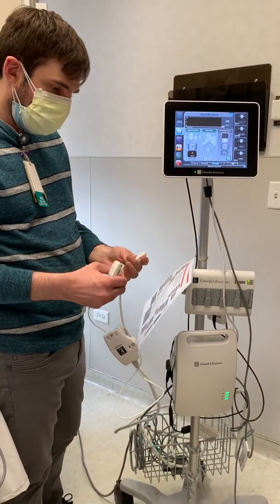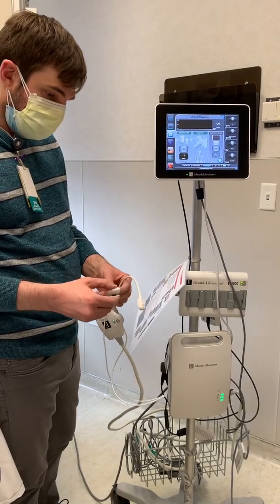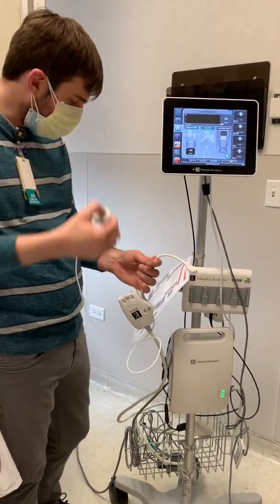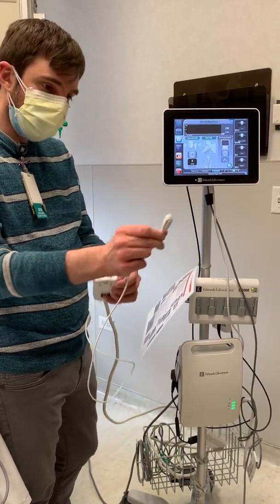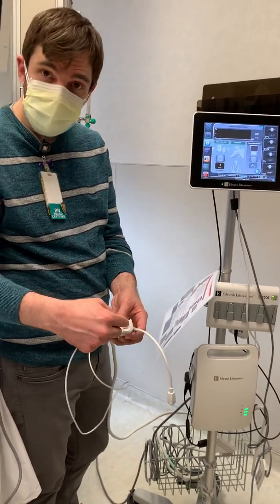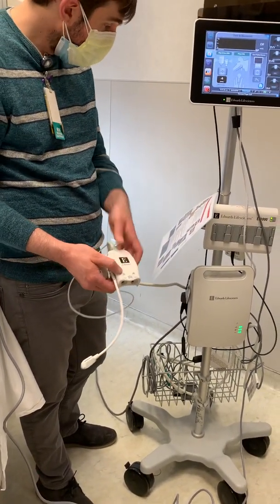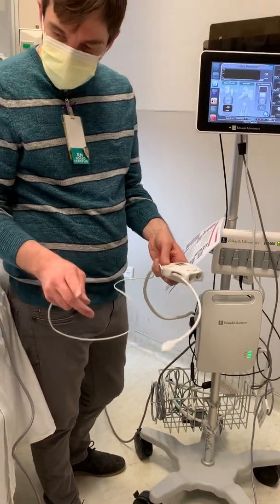Then you have to connect the cuff. This part clips onto the patient's gown pocket, and this part connects to the finger cuff itself. The finger cuff will have cords that connect into these slots here as well. It's your choice — cuff number one or cuff number two if you're for some reason using two. That's pretty much it with that part.